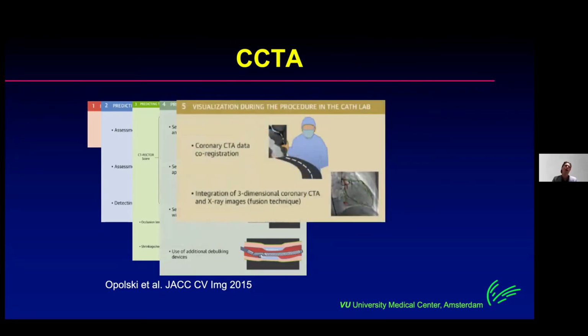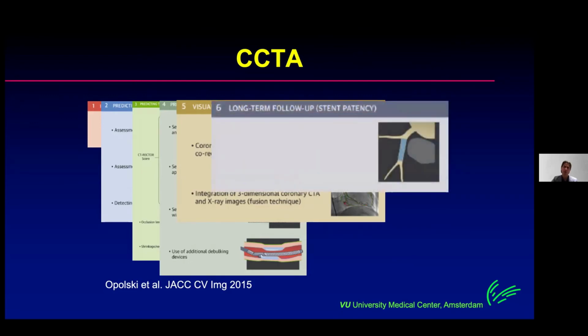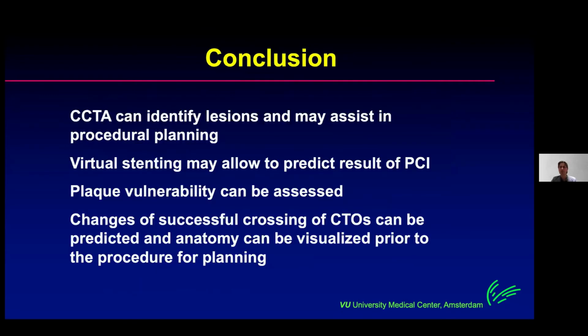And after the procedure, in the years to come, you can do CT coronary angiography again to assess stent patency, or, if they did bypass surgery, graft patency. So long-term follow-up is important.